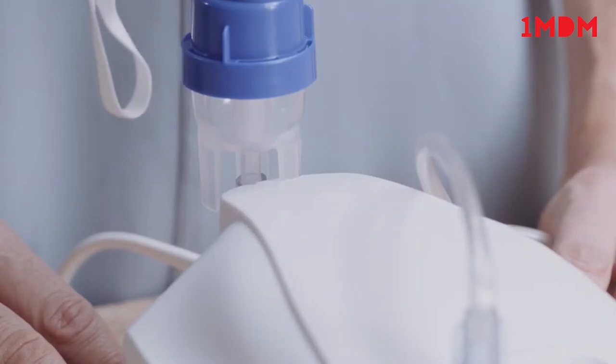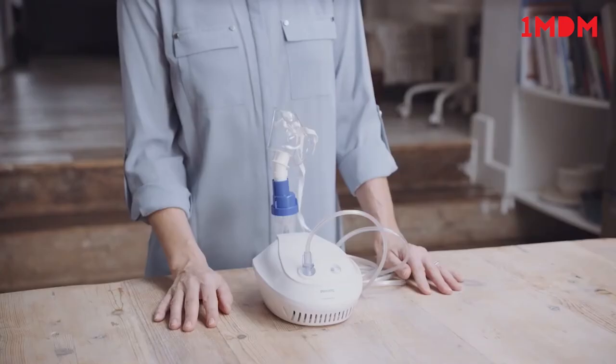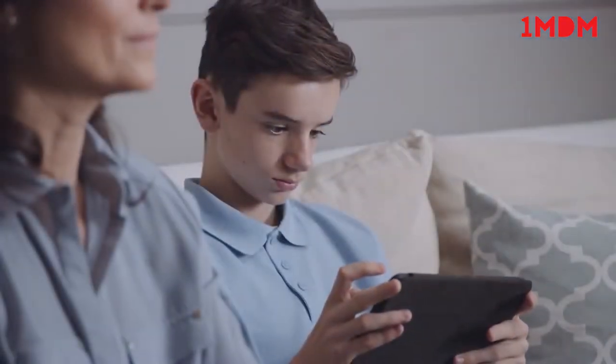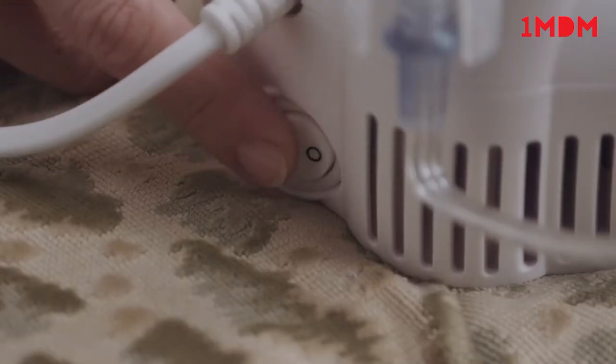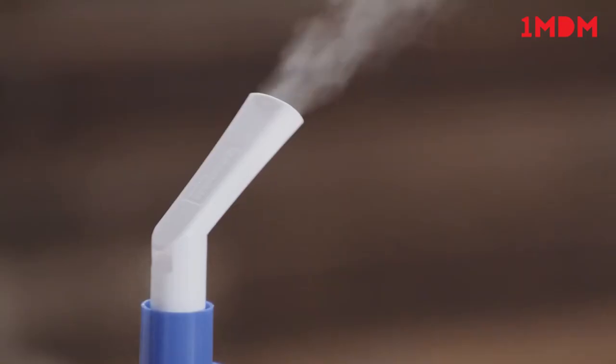Don't lay the Sidestream down on its side because the medication will spill out. You can use the parking post on your device for securing the Sidestream when not in use. To take the treatment, ensure the user is seated in a relaxed upright position and switch on the unit. Make sure mist is visibly coming from the mouthpiece or mask.